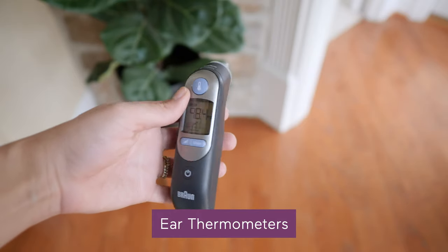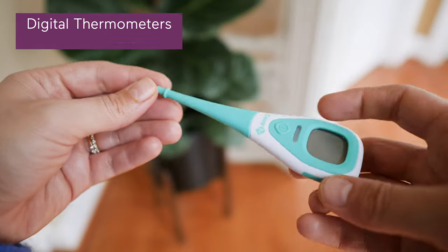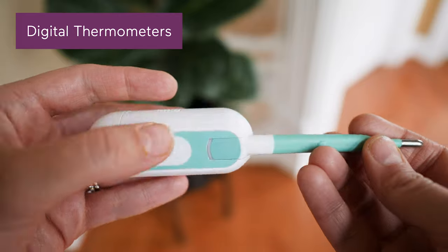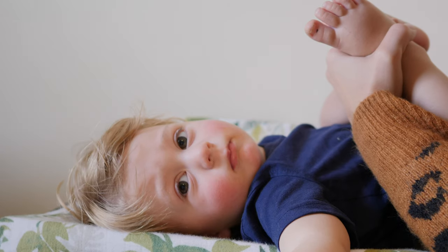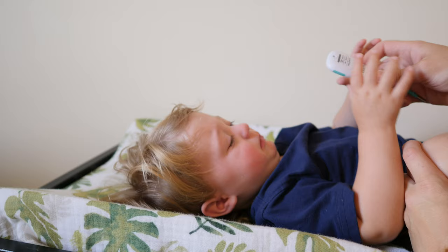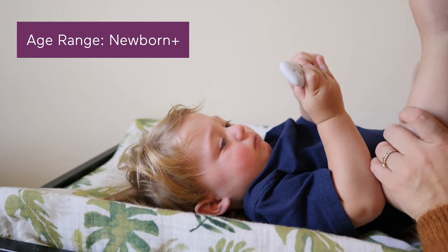The four main types of thermometers are digital, ear, forehead, and smart. Regular digital thermometers use electronic heat sensors to record body temperature. They can be used under the tongue, in the armpit, or in the rectum — yes, in the booty. Since rectal is recommended as the best way to check a newborn's temperature, it's a good idea to have one of these on hand in that first year or two.